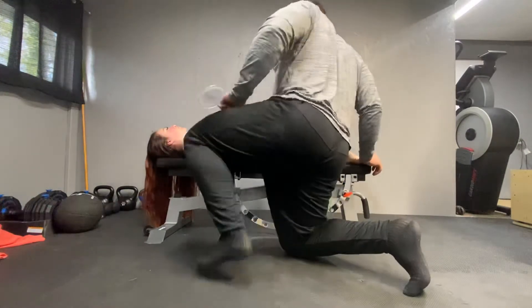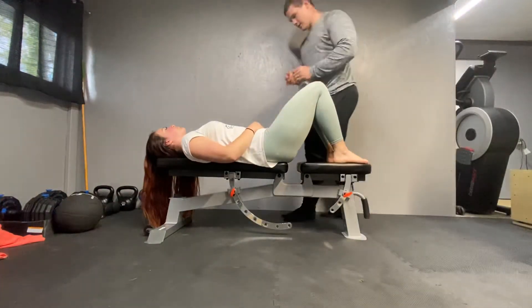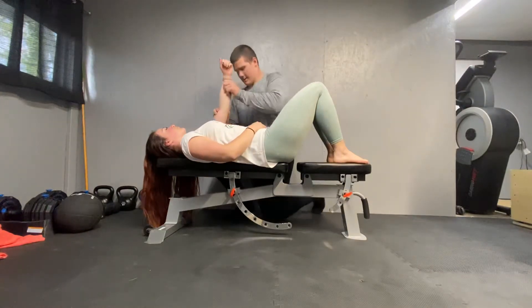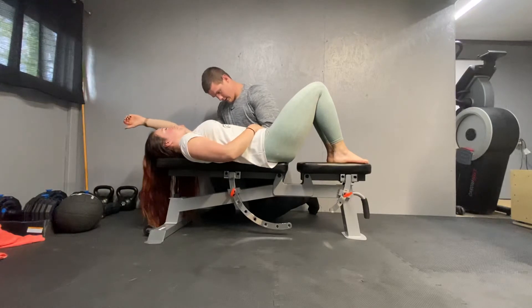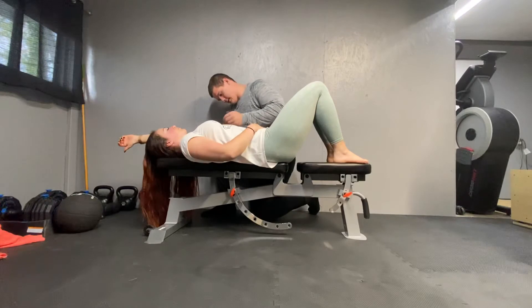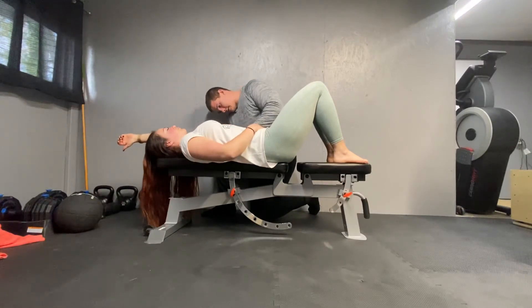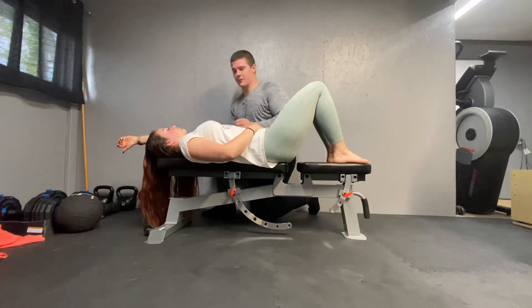Normal value is 160. Now let's get the other side. About there. Hold that. And that is about 163. Good. Thank you.